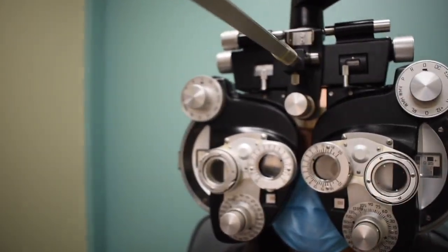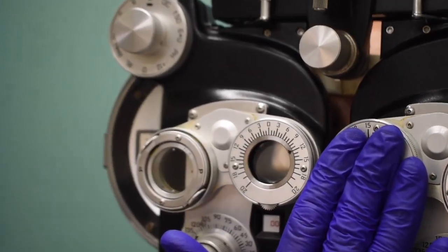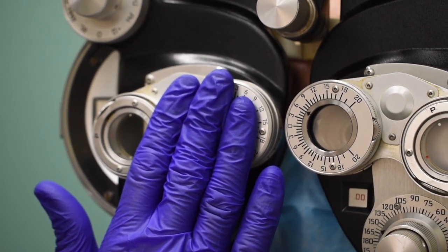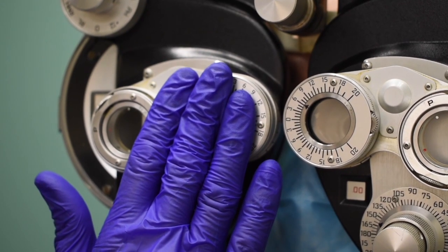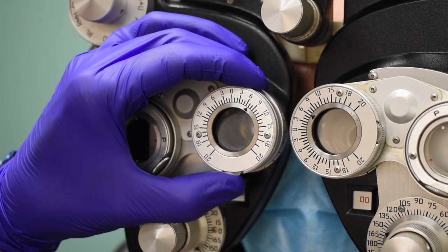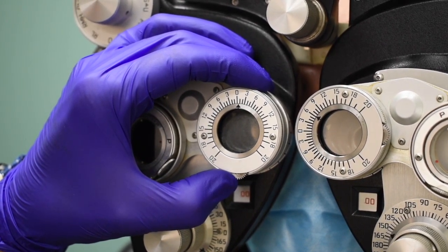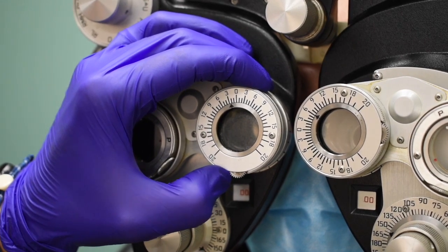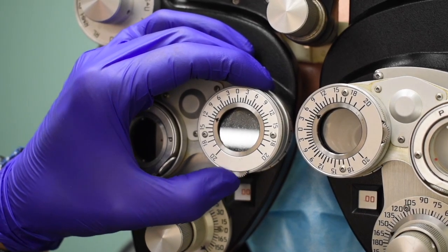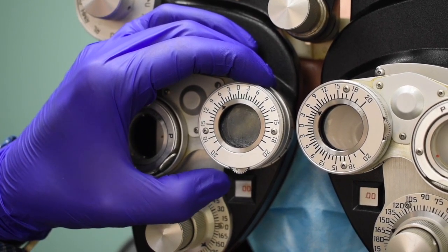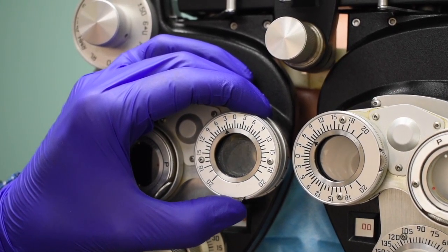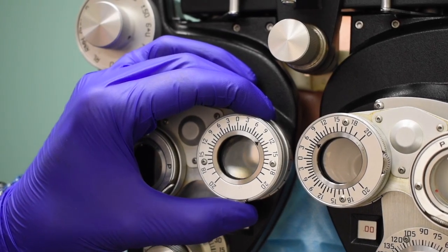Do you see 2 diamonds there, Phoebe? Yes. When I cover up this one, which one disappears? The bottom left. And how about this one? The top right. Good. I want you to stay focused on that target right there, Phoebe. The one on the lower left. Keep it as clear as you can. Tell me when the other one lines up above it. Now. I'm going to go way past. Tell me when they line up again. Now. So here I have 6-8 ESO. Reset it.